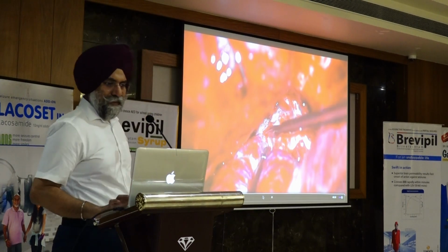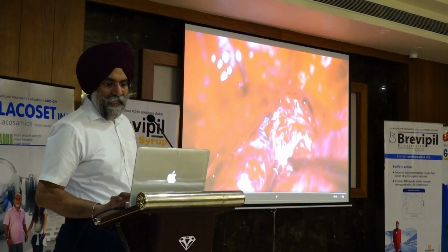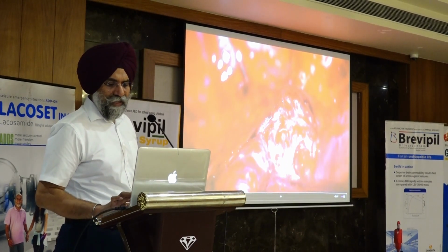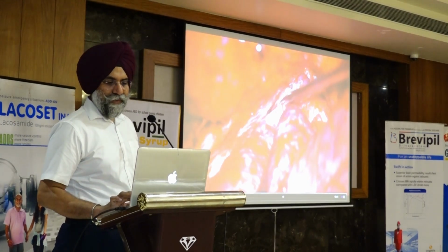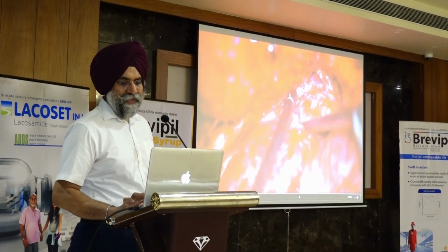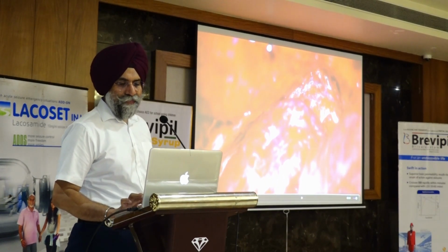And here it is, you can see that this is V2, this is V3. So this is actually a cavernous sinus tumor, and you just have to keep on peeling off this one layer of the dura over the cavernous sinus lateral wall, and it is not difficult. You just have to keep on with sharp and blunt dissection, both are required, going posteriorly. And here it is V3. This is the dissection of the V3, just lifting the dura off the V3. These are the fibers of the V3, overlying it are just the dural margins.